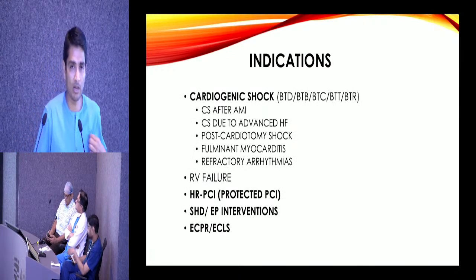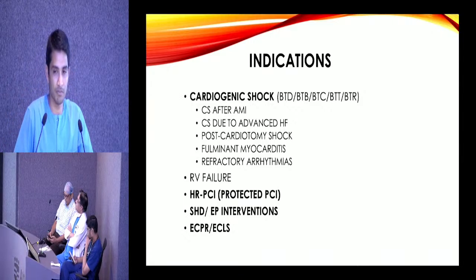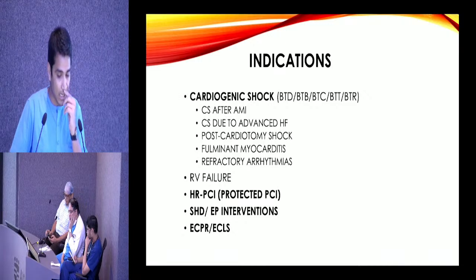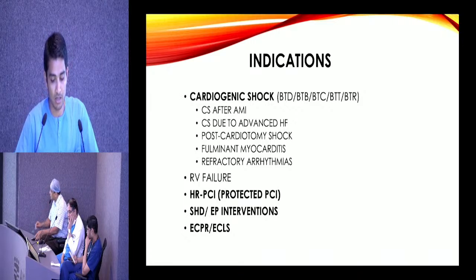Just a caveat, we'll talk mainly about left ventricular support devices. We are not really covering RV shock in today's symposium. So the main indications are cardiogenic shock, either due to acute MI or due to advanced heart failure, like Dr. Rajiv mentioned.